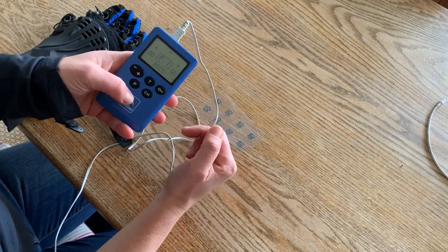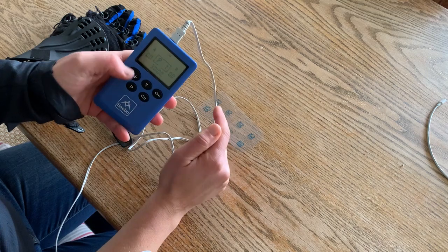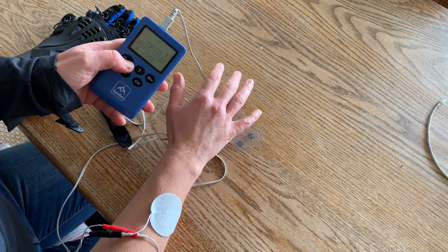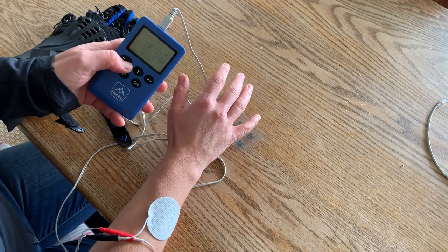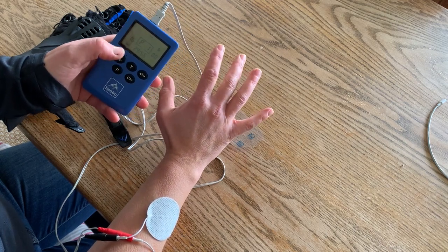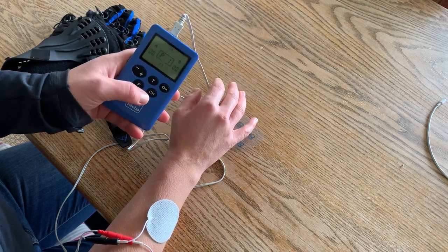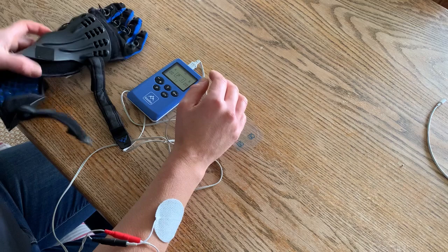Turn the Stim Pro on — I've got program one for the upper limb, with it in channel A. I'm going to make it flash and then turn it up just so I can check, before I put the glove on, that I'm happy with where the electrodes are — which I am. So I'm then going to press pause by pressing the T button.